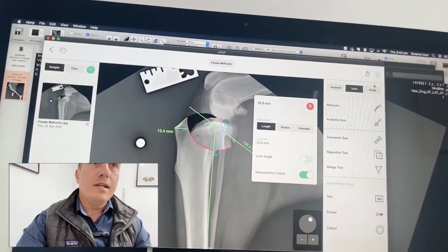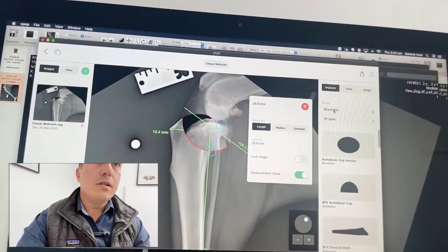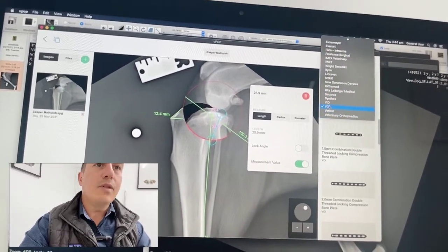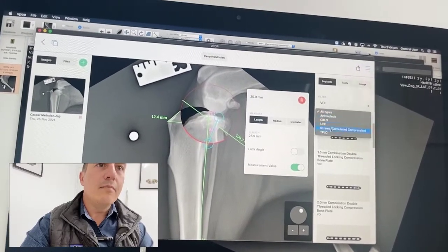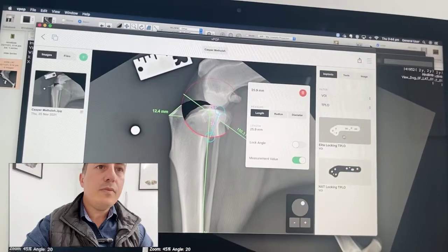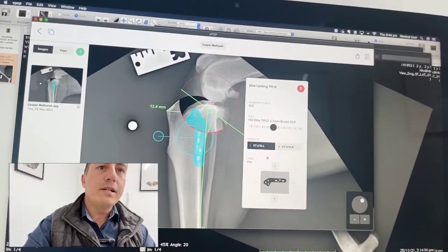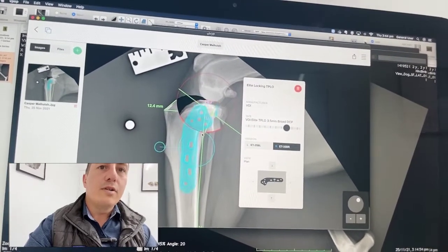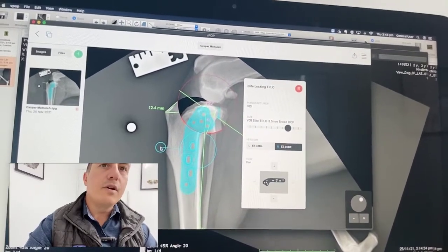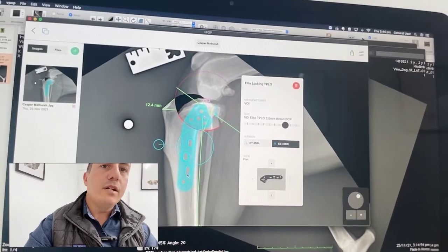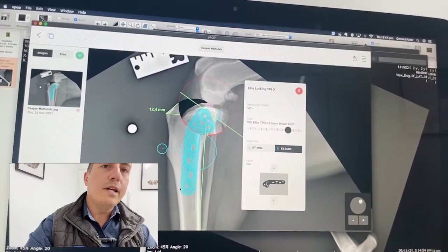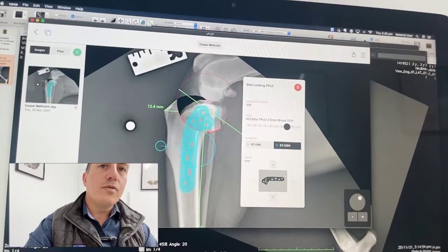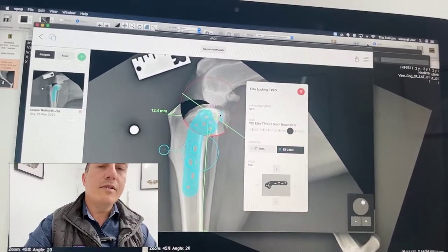The final thing I'm going to do is take an implant. I'm going to change here to VOI — this is nice because we've got all these different templates and heaps of different implant choices. We're going to come to VOI, hit TPLO for the type of implant, go to the elite plate which is what we use, and then I can select right or left. This is starting with a 2.7 millimeter broad, which is way too small — we're going to be looking at a 3.5 broad plate. And that's going to work pretty nicely. We can see all my screws are engaged in the appropriate part of the bone — we're not going to be going through the cortical bone in the cranial diaphysis, and all screws are going to be nicely located within the proximal segment.